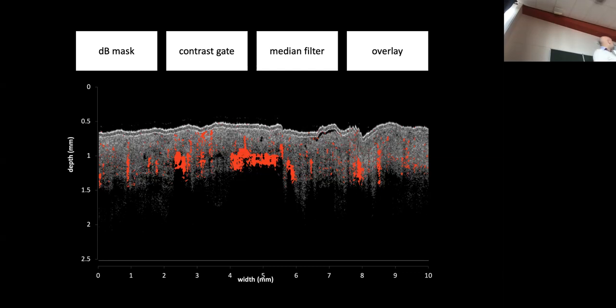The microcirculation, all these tiny blood vessels, are visualized here, segmented based on the speckle change. And what you see here in red is the perfusion of the tissue. It does not tell us yet if it's well perfused or not, but at least we are able to do it now with OCT. And it is again some kind of an optical biopsy of the tissue that gives you right away an answer on the state of the tissue.